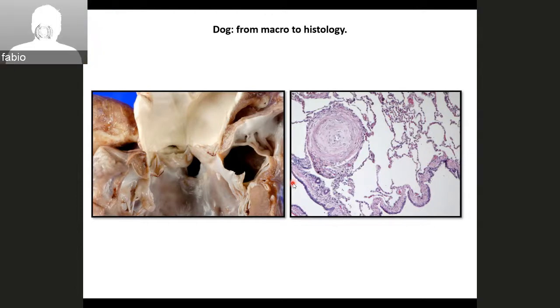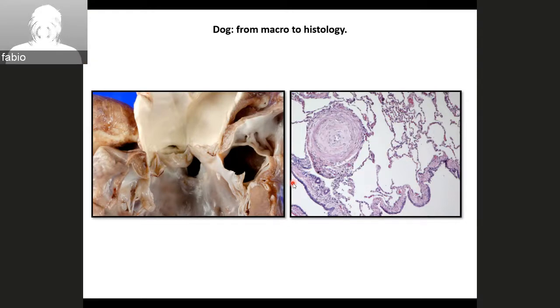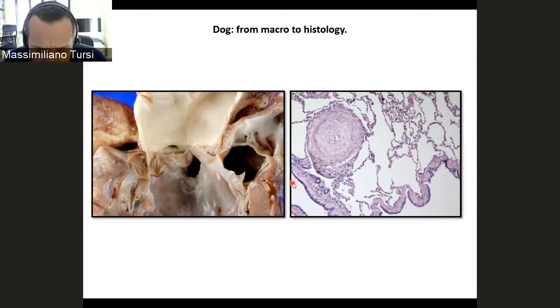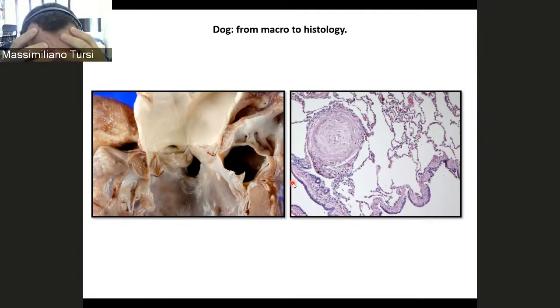Yeah, I think maybe for you it's better to see a wall with a severe thickening. Because it looks like there are layers around it. But also because for the pathogenesis, plexiform degeneration is the late stage.